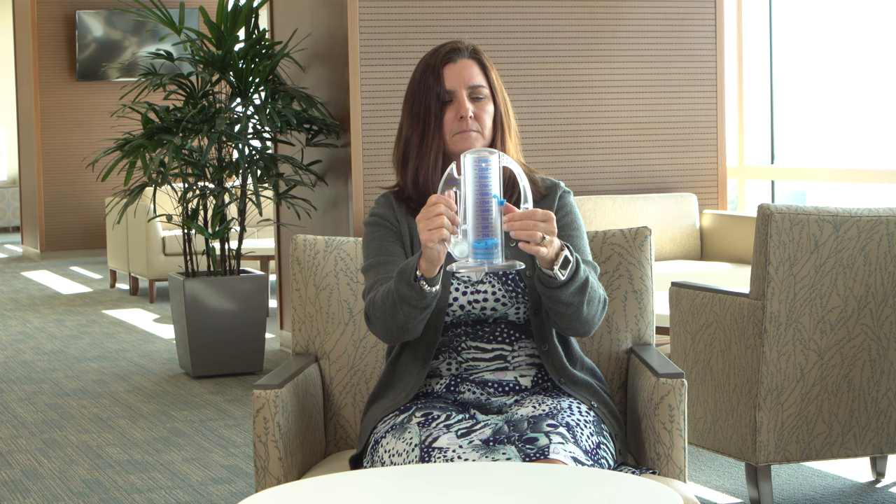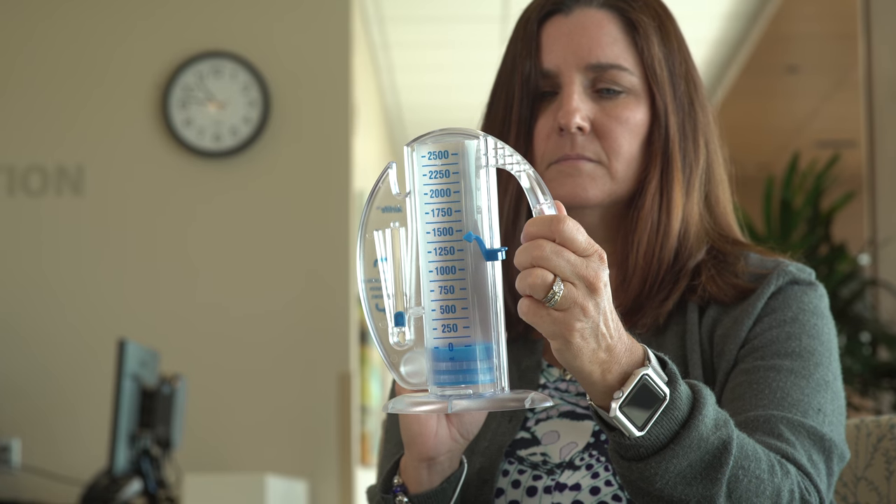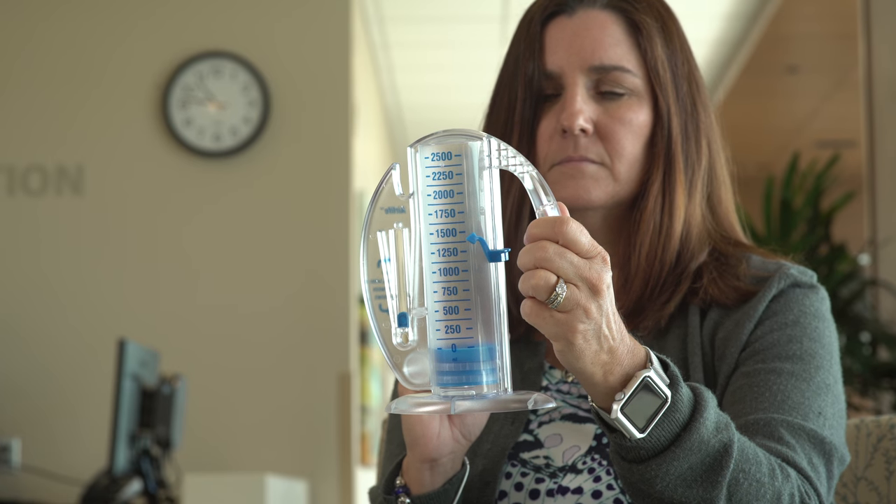Position the marker on the left side of the spirometer to show your best effort. Use the marker as a goal to work toward during each slow deep breath.